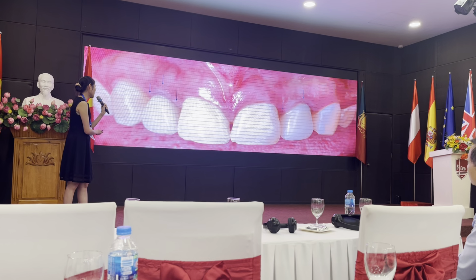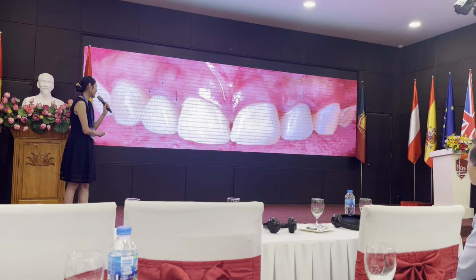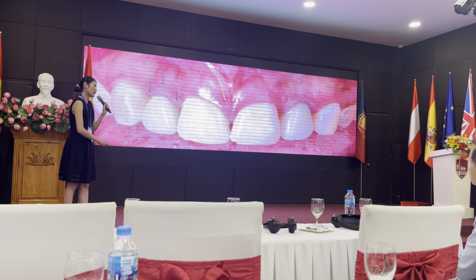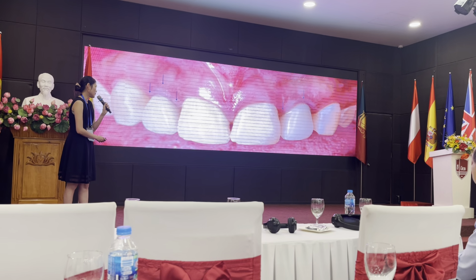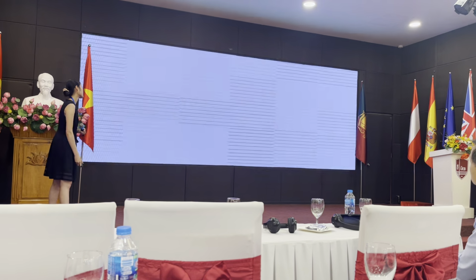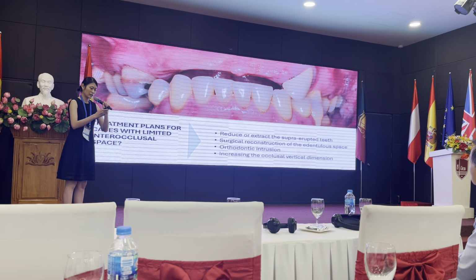The soft tissue, if you compare 7 to 10, 10 seems a little bit less ideal. So I would say, if during the healing stage we can try to push the tissue a little bit, maybe the outcome will be different. So that's something you have to think about, especially trong cái quá trình lành thương thì có thể đôi khi chúng ta hơi nén cái mô mềm quá mức. Thì cái này là cái điều mà chúng ta sẽ cần cân nhắc trong cái quá trình chúng ta tạo hình mô mềm.